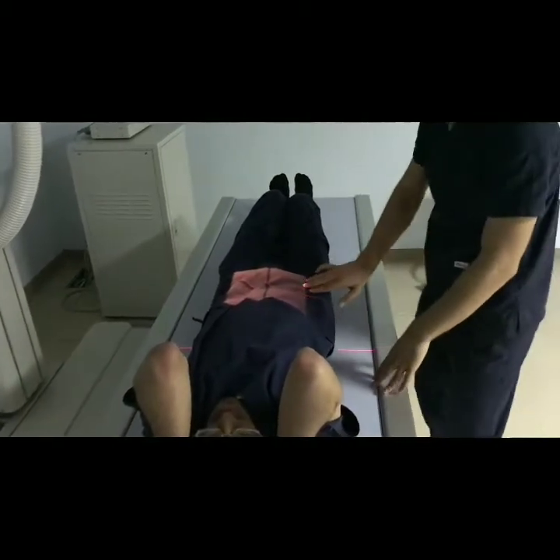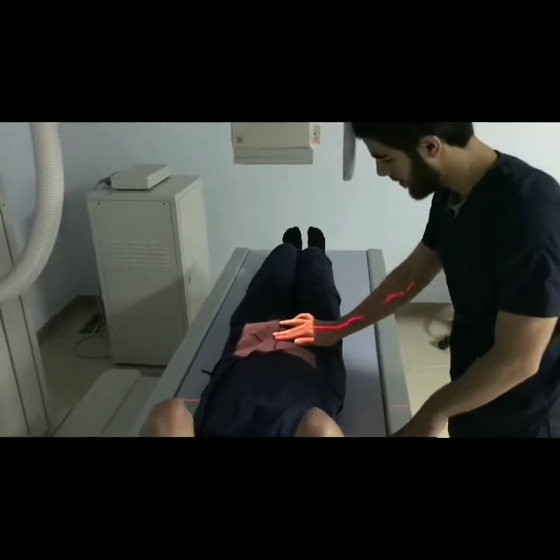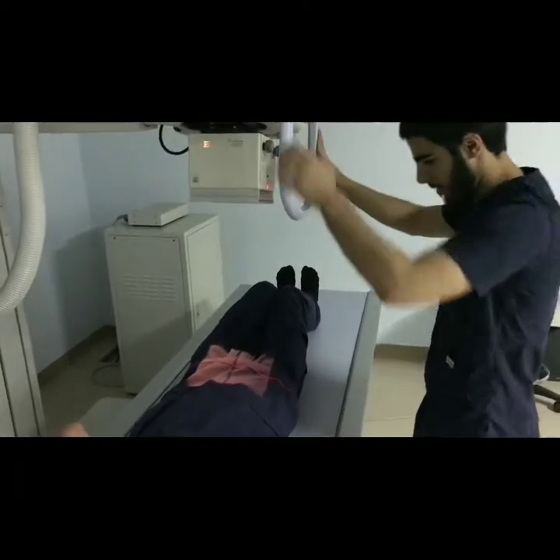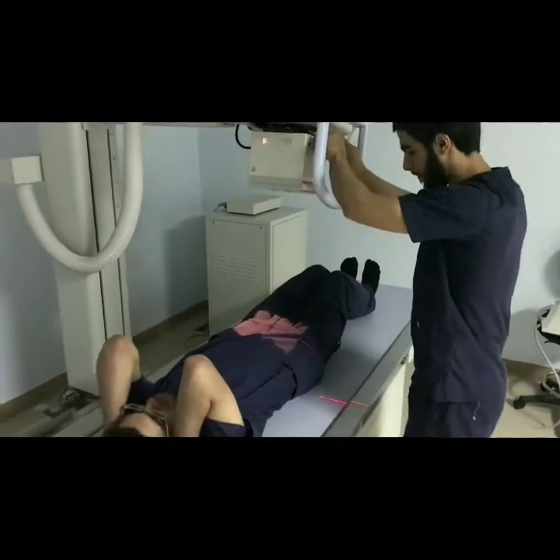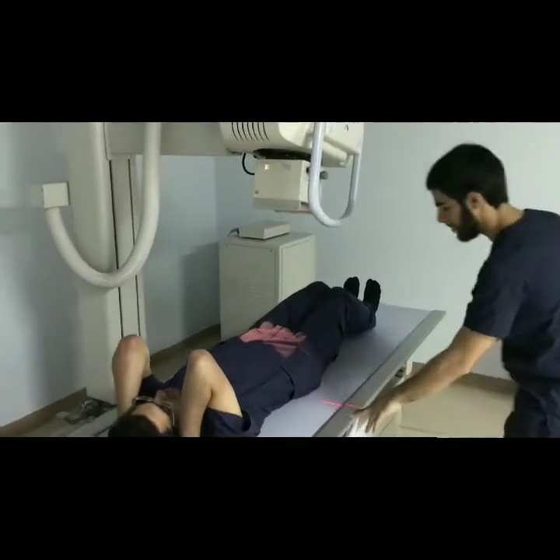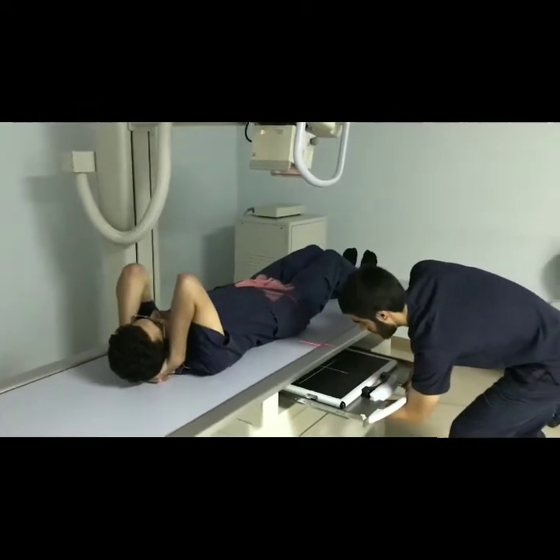Palpate nearby landmarks for accuracy and modify the collimation accordingly. This step is critical so you might want to double check it. Make sure the image receptor is in the middle of the central ray.